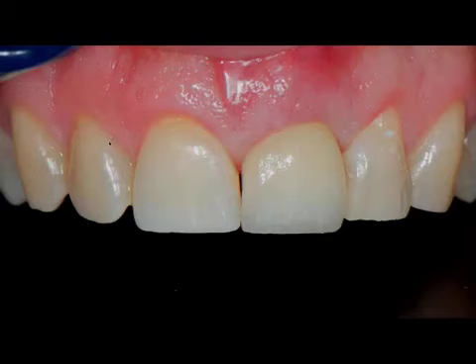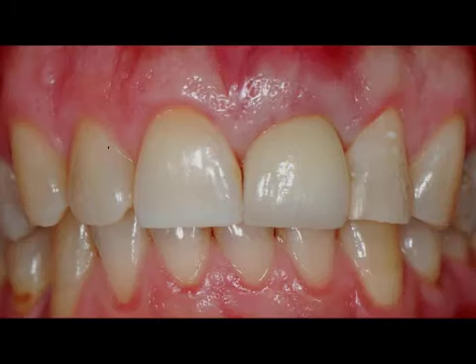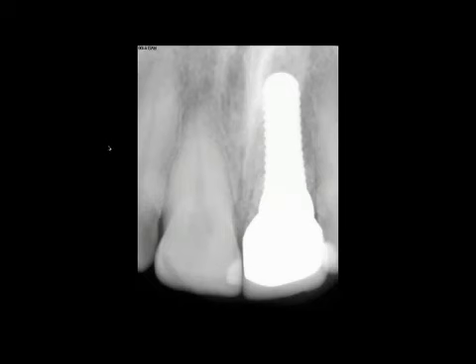In this case, an Emax crown was cemented in place. I usually cement my cases with Fuji cement. And this is the final result, and we can see how nice the tissue migrated coronally and how the soft tissue contour was maintained throughout the healing phase.